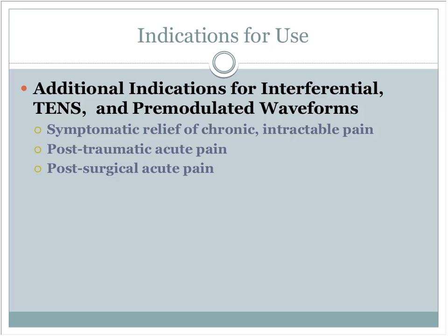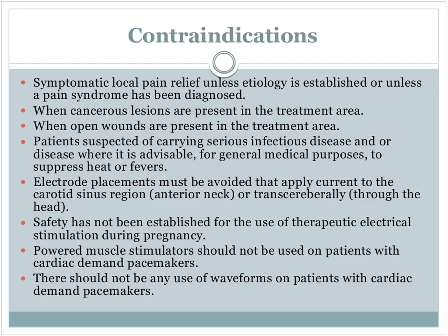You can dehisce a wound. So, just that awareness. Person still has sutures in, I don't usually put TENS or even any kind of e-stim on them at that point. If they've had a dehisced wound, well, then maybe you can use some high volt current to increase blood flow, hopefully maybe heal that a little faster. But that's just, you check with the doctor on that.